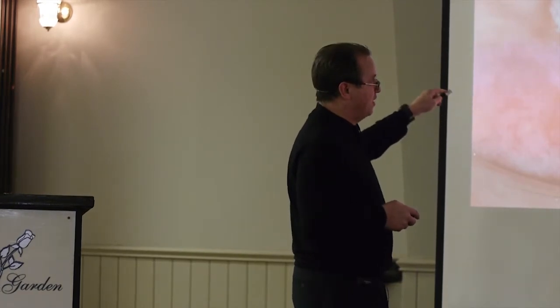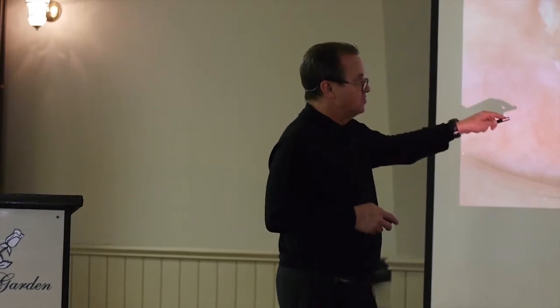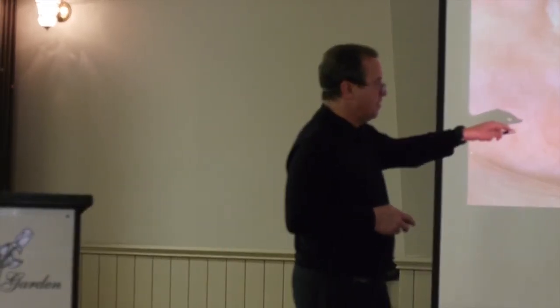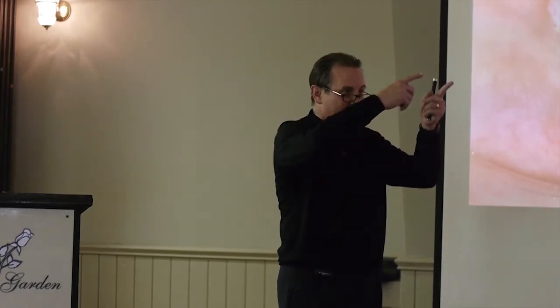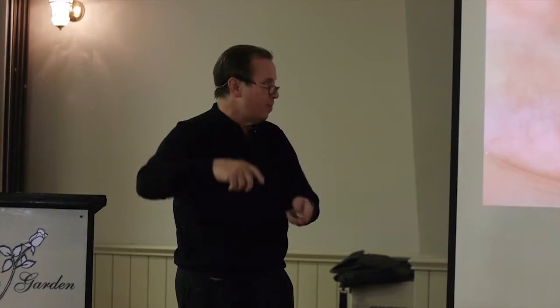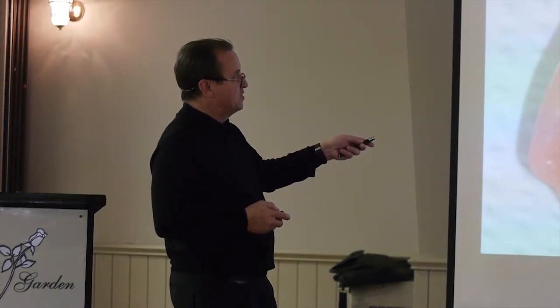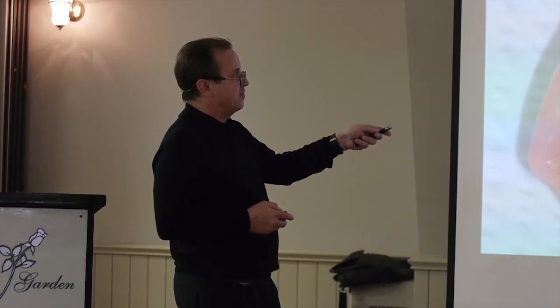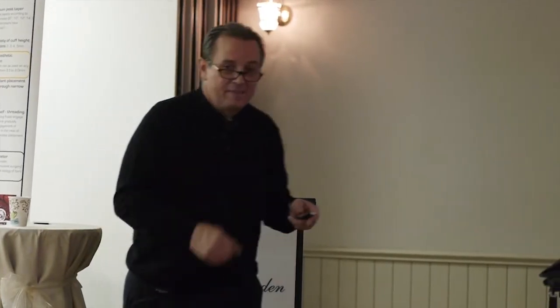We drilled a hole here and drilled a hole here and tapped it and screwed in a locator attachment there, screwed in a locator attachment here. And then here in the mouth, using this electric handpiece, we kind of milled what looks like a standard Preat bar so that we can incorporate this into the overdenture. So it snaps here, snaps there, and here's our third point of stability. And this has really worked out really nice. But the point is, she goes through this whole major big surgery thing, and the prosthesis never has really stayed in all that well all these years.